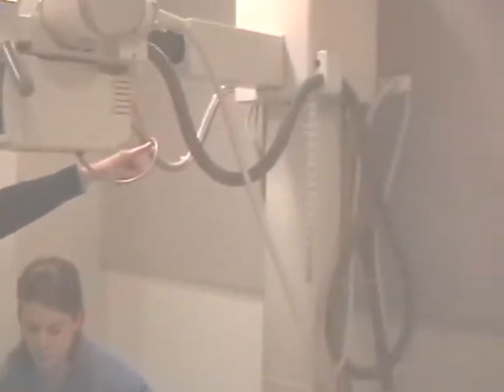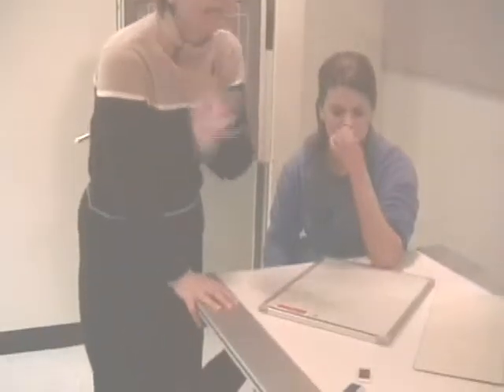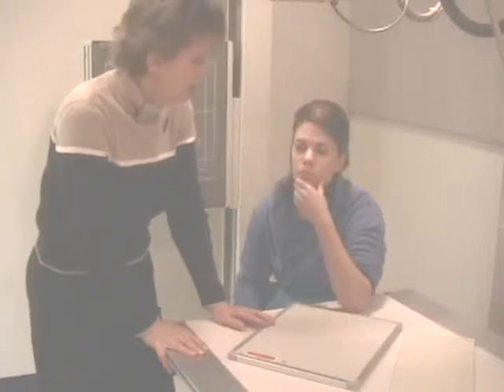I'm going to protect my patient's reproductive organs. I'm going to have my distance set at 40 to the tabletop. I'm going to be dividing my cassette in half, and these projections, an AP and a lateral, will be done on 11 by 14 lengthwise.